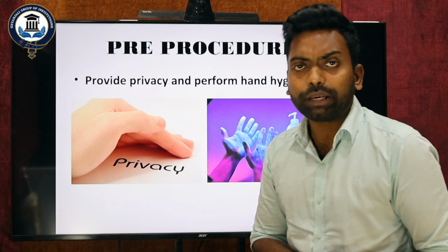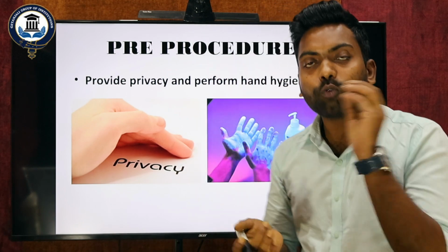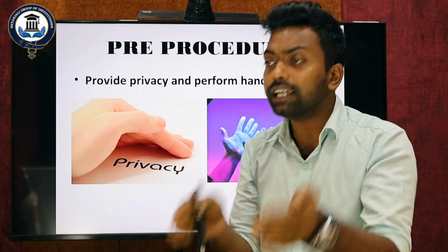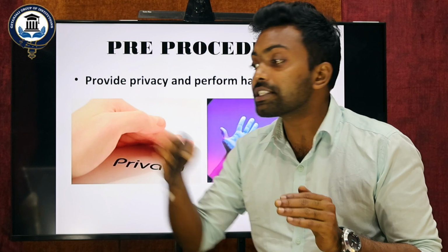Provide privacy to the patient, and go for your hand washing. Yes, this is also one of the priorities you must do. Before doing any medical procedure, as we know, sterility is very important in order to prevent cross infection.